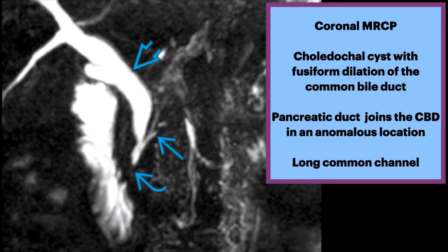On this coronal MRCP, we see a choledochal cyst showing fusiform dilatation of the common bile duct. The pancreatic duct joins the common bile duct in an anomalous location, as evidenced by the straight arrow. This creates a long common channel that measured approximately 1.8 centimeters in length, as shown by the hooked arrow.